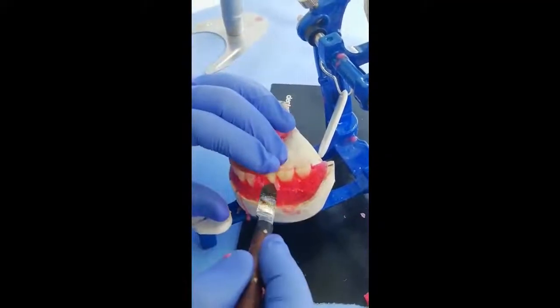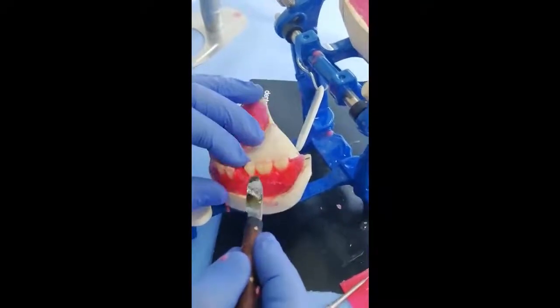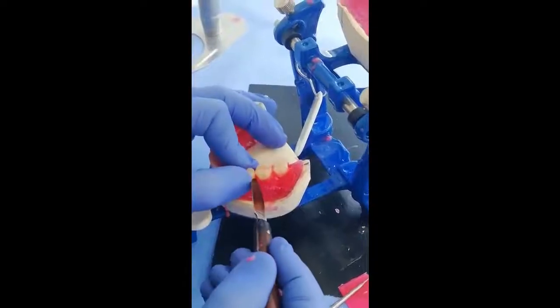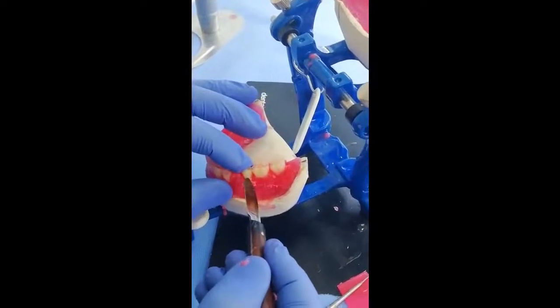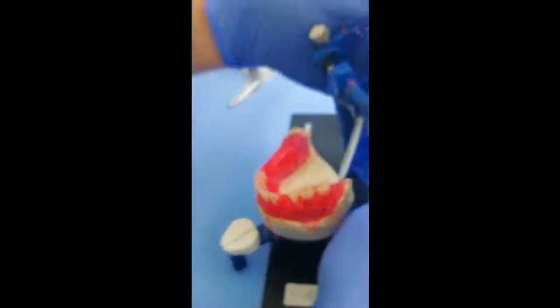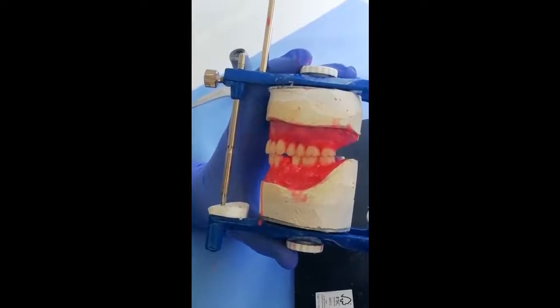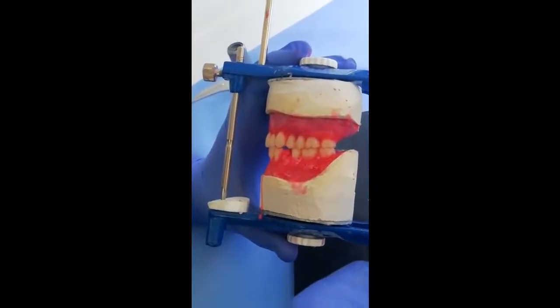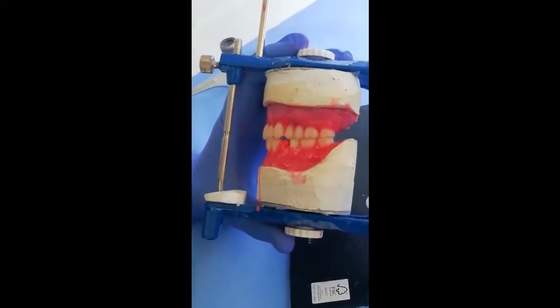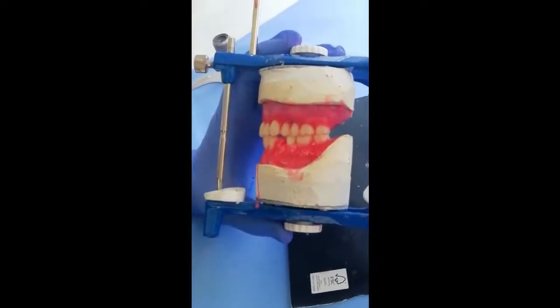in a vertical relation where the long axis of the tooth is vertical, mesiodistally, and slightly to the lingual, buccolingually, and we see that it occludes perfectly in its position, achieving a maximum intercuspation while we are in the centric relation position.